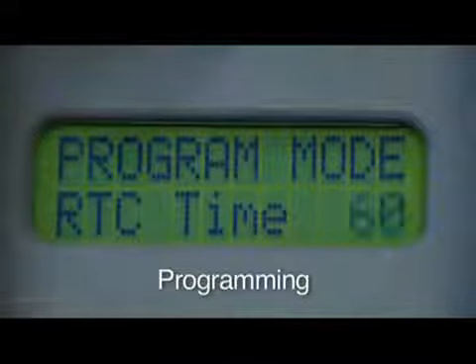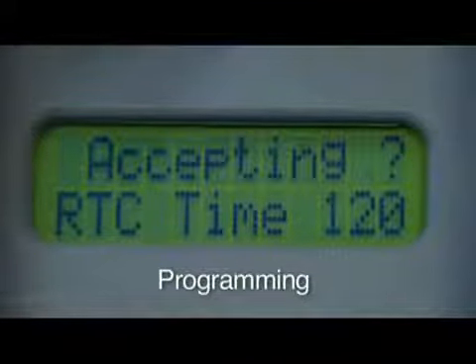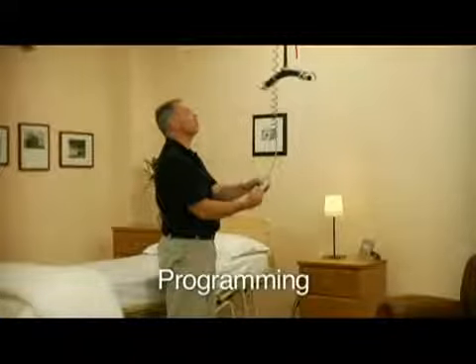Here you can see the unit's return to charge time being programmed. Consult your manual to review the C-Series other programming options.